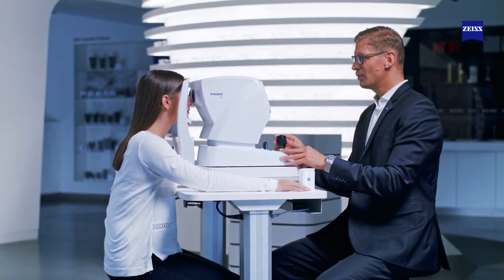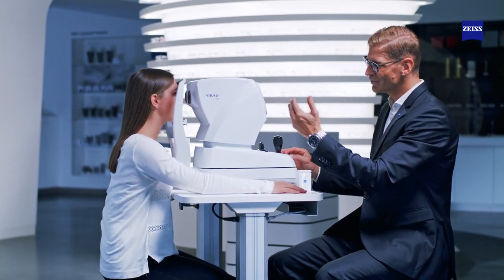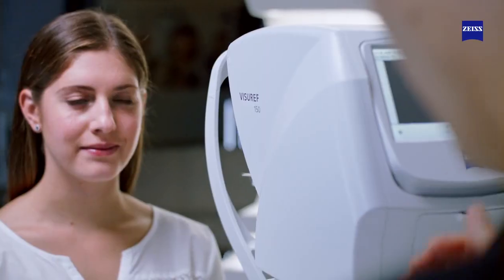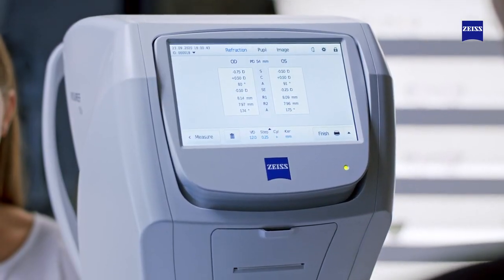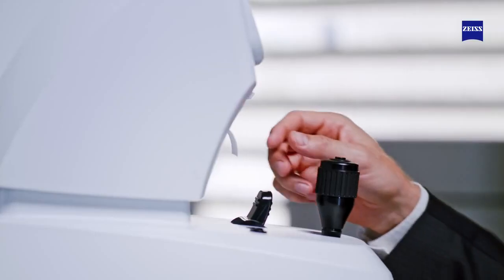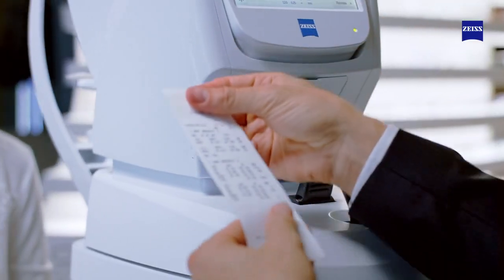Previous measurements are easily retrievable via the local device memory. Users can view all details for up to 10 measurements per eye and their average values. Results may be printed out using the integrated thermal printer or by means of a network printer.